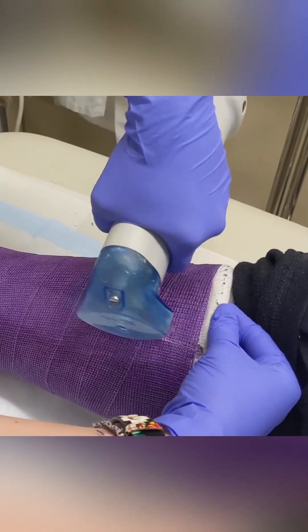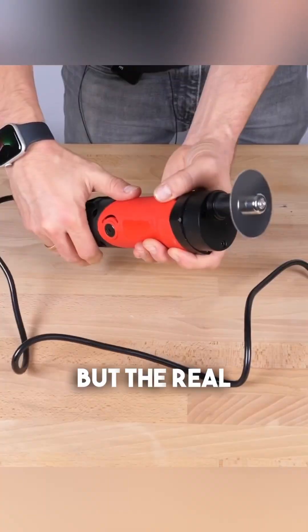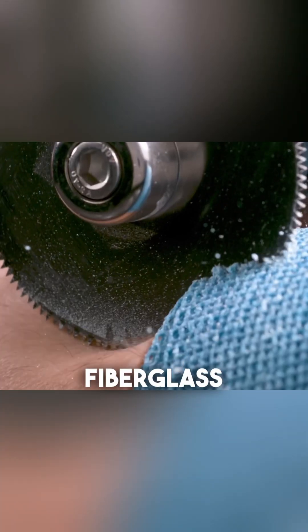Why doesn't a cast saw hurt the skin underneath the cast? You might think doctors are just super careful, but the real reason actually lies in the saw itself. Unlike a regular saw that spins, this one vibrates. These rapid vibrations allow the saw to cut through hard materials like the plaster or fiberglass of a cast.